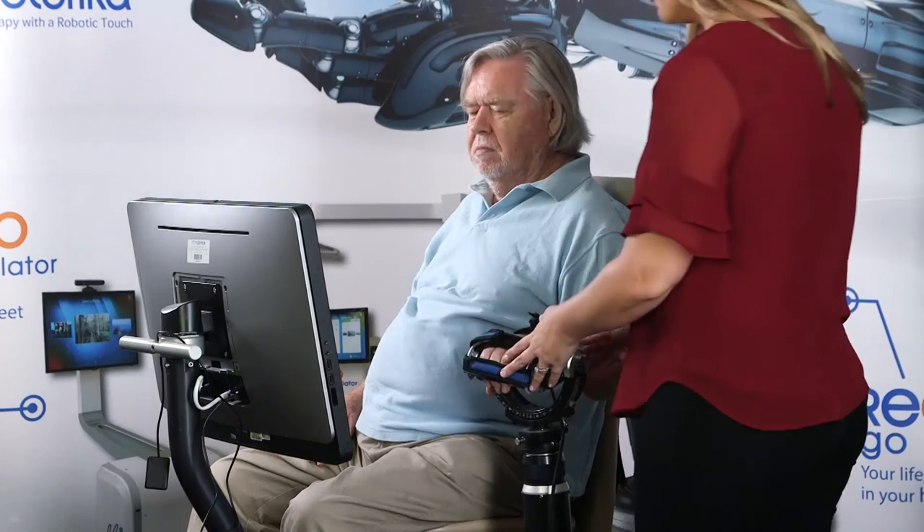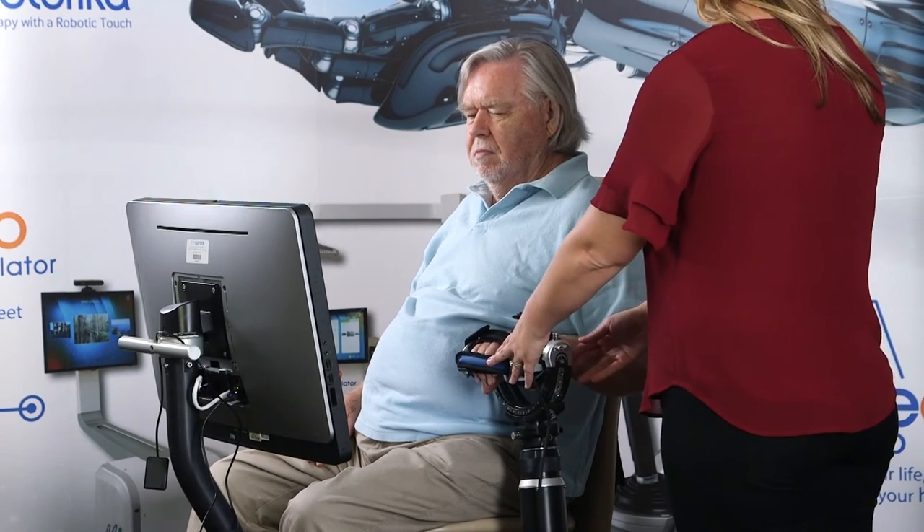Five levels of assistance are available to allow therapists to work with many different types of patients. The patient begins by focusing on proximal movement and then progresses to incorporating distal movement.